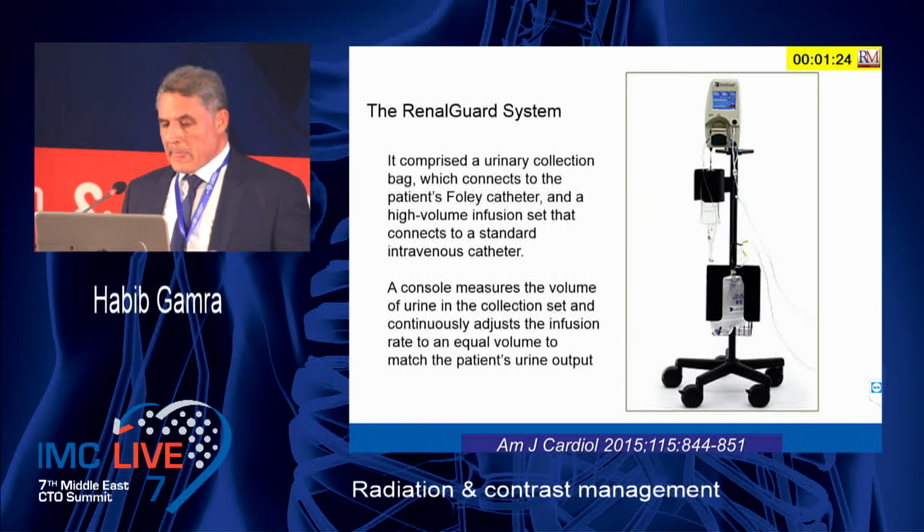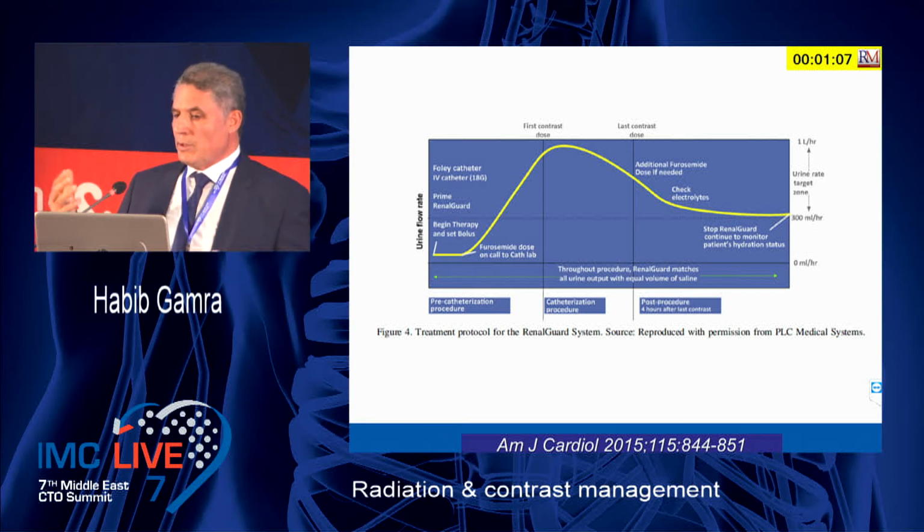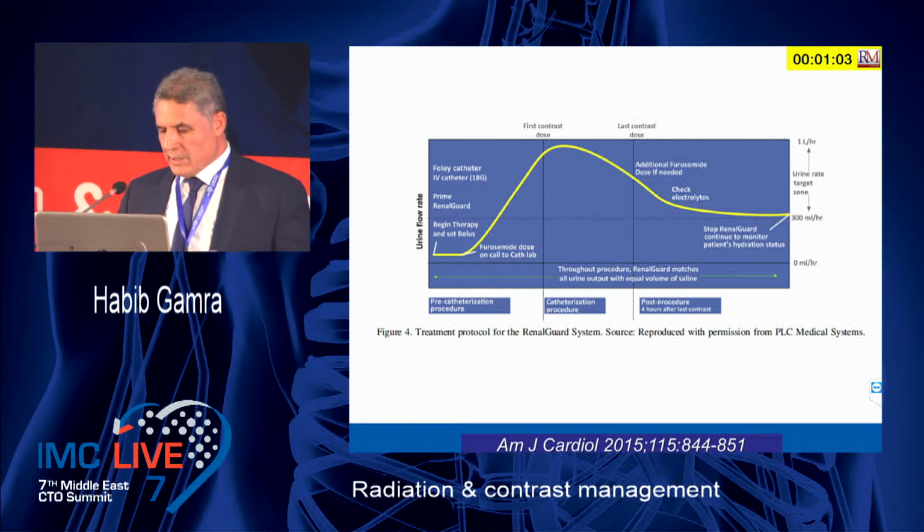This is the RenalGuard system. Actually, what is it? It's comprised of urinary collection, and there is a protocol where you give some Lasix to the patient. But this device will allow you to rehydrate the patient with the same amount that was lost by the patient.